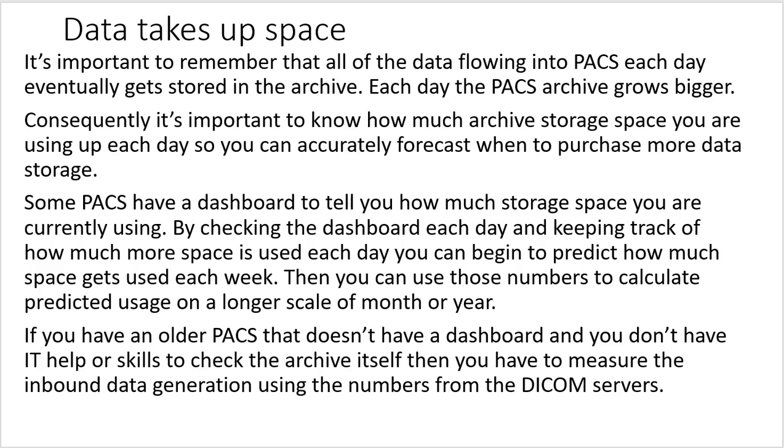So data takes up space. It's important to remember that all of the data flowing into PACS each day eventually gets stored in the archive. Each and every day the PACS archive grows bigger. Whatever your PACS archive file size is today, it's going to be bigger tomorrow and bigger the day after that. Consequently, it's important to know how much archive storage space you are using up each day so you can accurately forecast when to purchase more data storage.